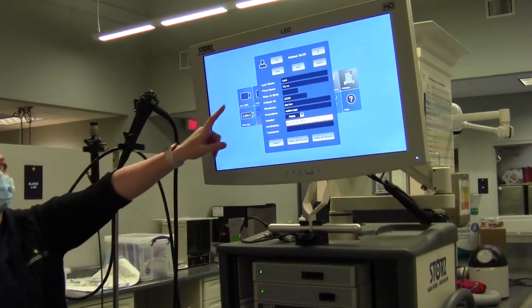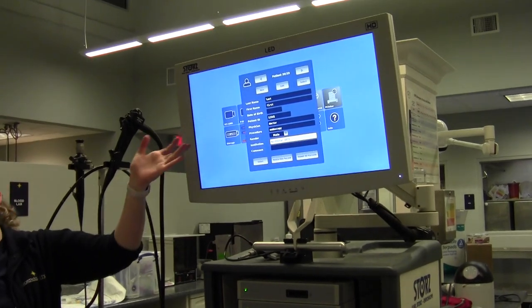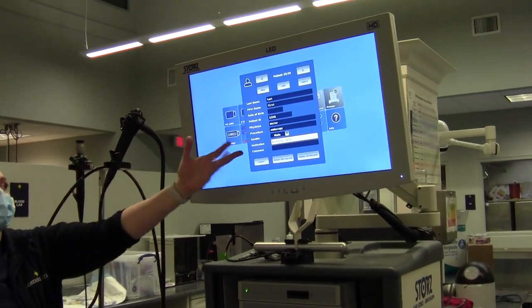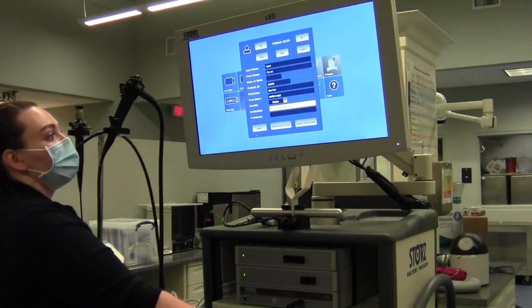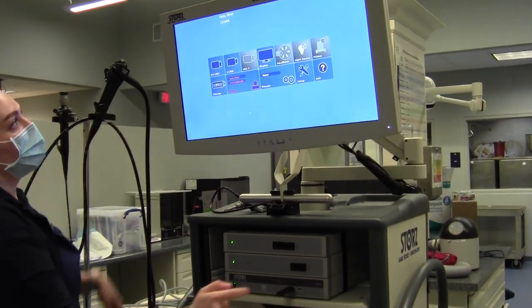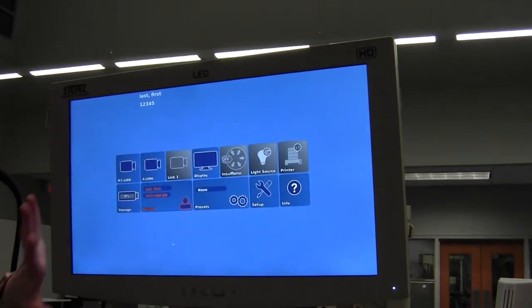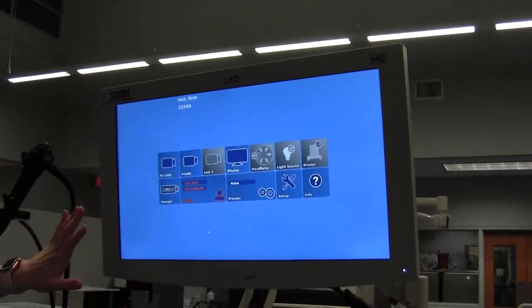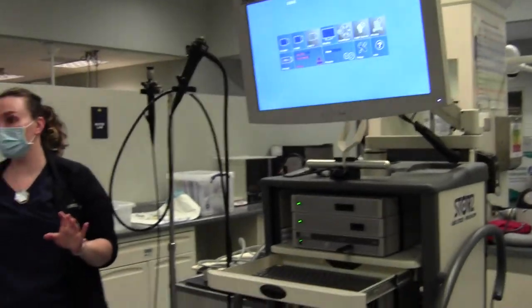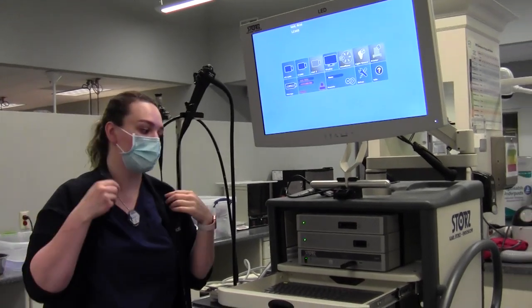That's all you need: last name, first name, ID number, the doctor, what procedure you're doing, and the gender. Then you scroll down to select and now your patient is active. Whatever procedure or pictures that you take will now be under that patient. It's important with every procedure that you make sure the patient's information is correct.